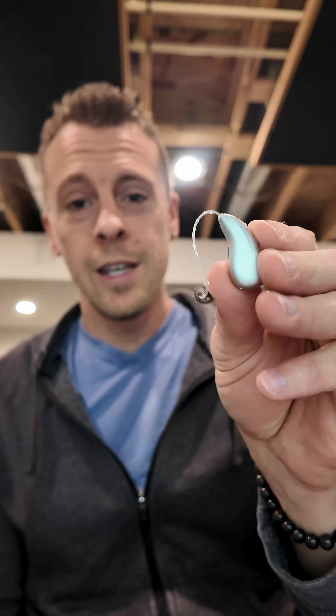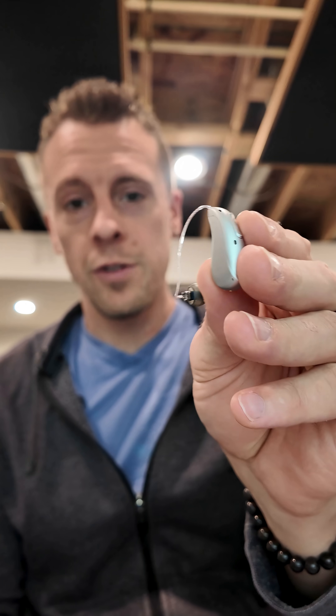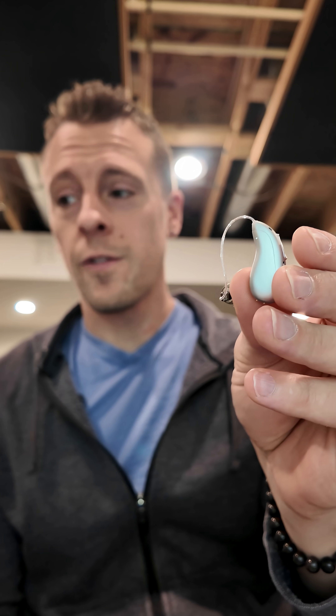Hi everyone. I am in the process of testing the new Phonak Audeo Infineo Ultra Sphere. They look like this, which is the exact same as the previous Audeo Sphere model. It is pretty much just a firmware update, and I've mentioned that in some of my other videos, and we'll address it also in the longer review.